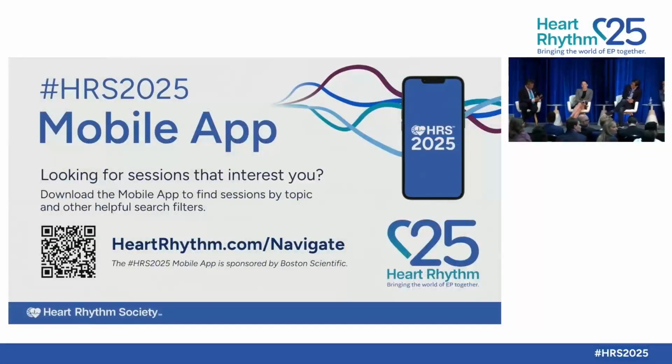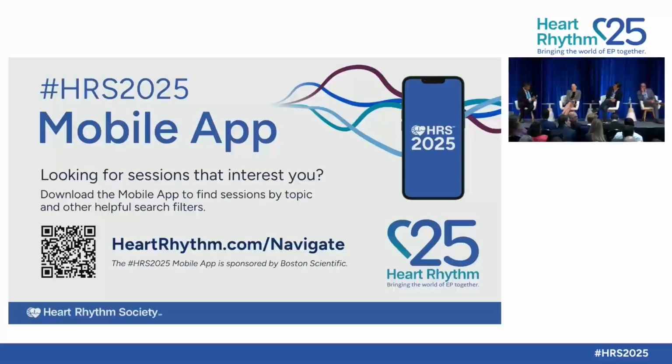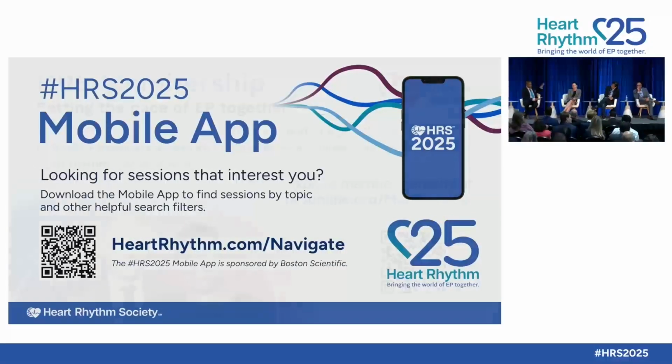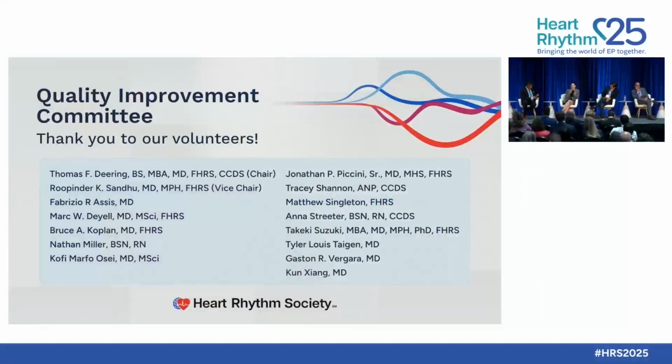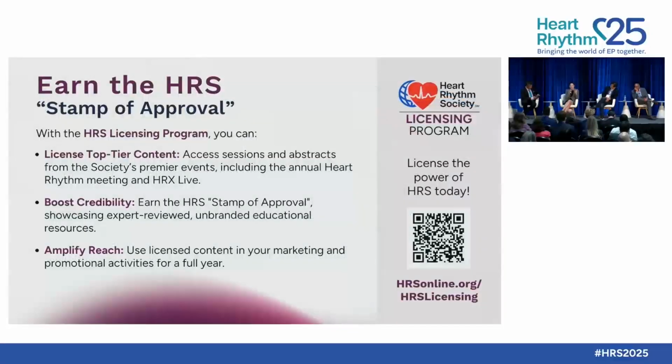First question, are there any surprises from the Volta AI data in terms of the proportion of dispersion sites, where you see them compared to what you expected? Tina, maybe I'll throw that one to you. I think it's in line with every other mapping study I've ever seen. About a third of the sources has always been in the right atrium. The rest has been in the left atrium: the base of the appendage, the posterior wall, the septum. I am happy that the mapping studies are in agreement, that they're looking at the same underlying mechanism, whichever algorithm they're trying to use.